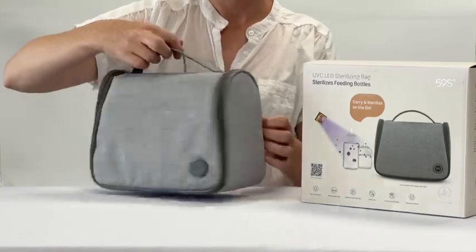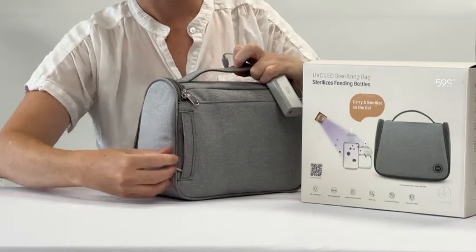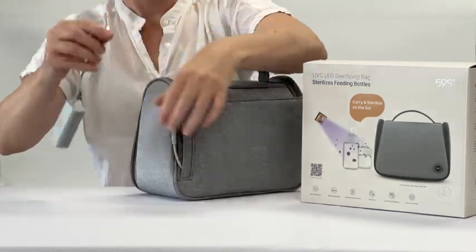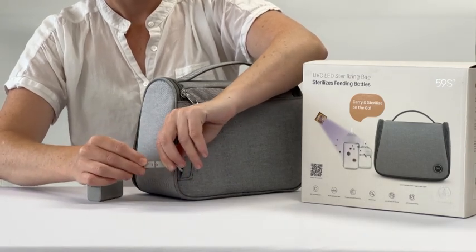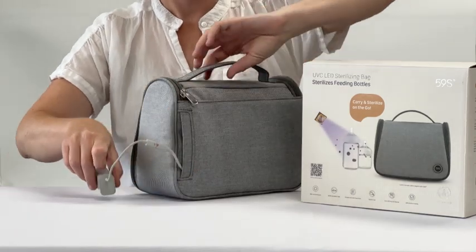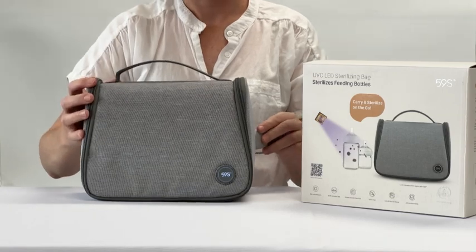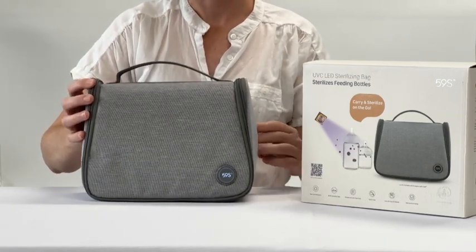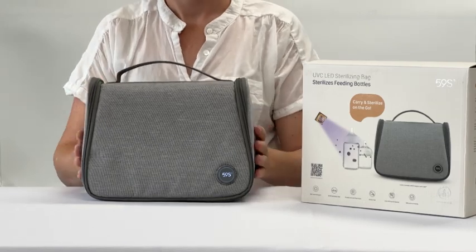Attach the power bank into the back sleeve of the 59S travel bag. There are two orange arrows that indicate which direction the plug needs to be plugged in. Once plugged in you will hear an audible beep and the light on the front of the bag will illuminate, indicating that there is charge in the power bank and that the bag is working.